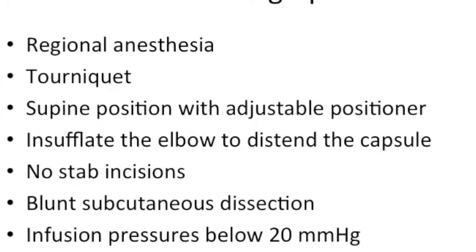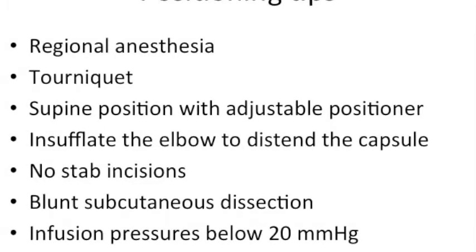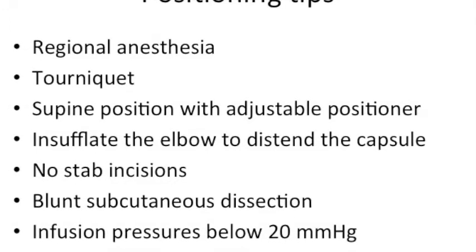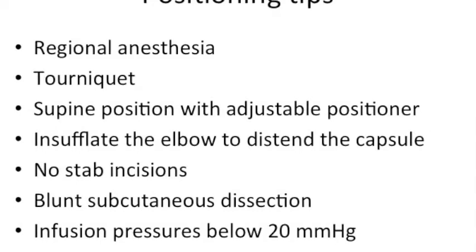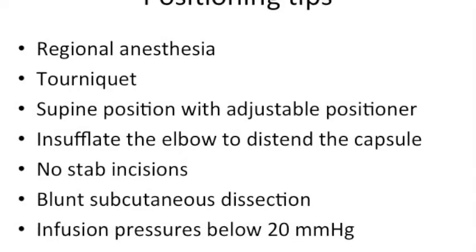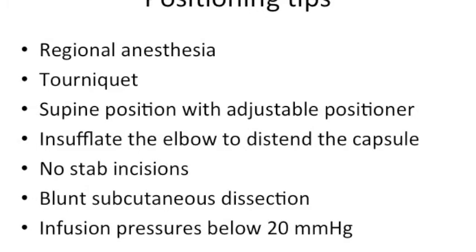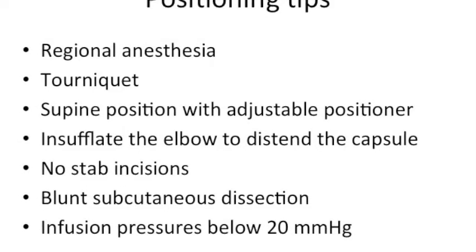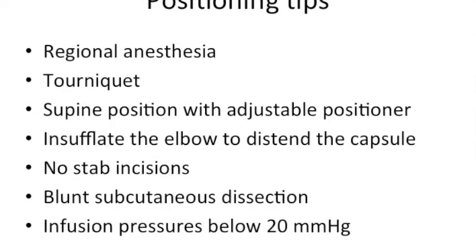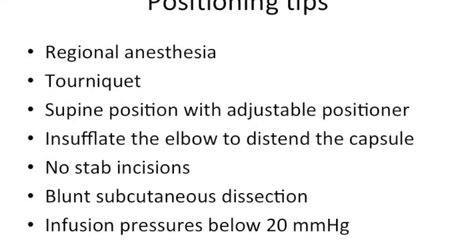As in adults, all portals are established with the elbow in 90 degrees of flexion to minimize the proximity of the neurovascular structures. Portals are made close to the capsular insertion on the supracondylar ridge to prevent entrapping capsular tissue between the portal and the humerus, which would decrease the joint volume and compromise exposure. Lastly, we only incise the skin. No stab incisions are made. This is followed by blunt dissection through the subcutaneous tissue down to the level of the capsule. This helps to minimize the risk to the surrounding structures by displacing them out of the proposed path prior to trocar insertion. All trocars are blunt tipped.